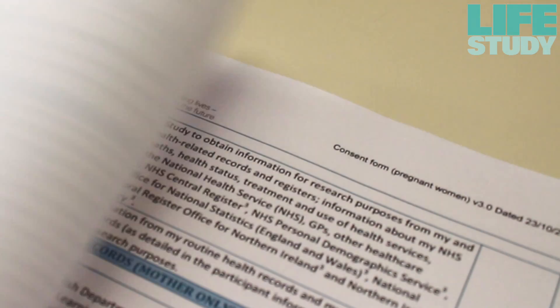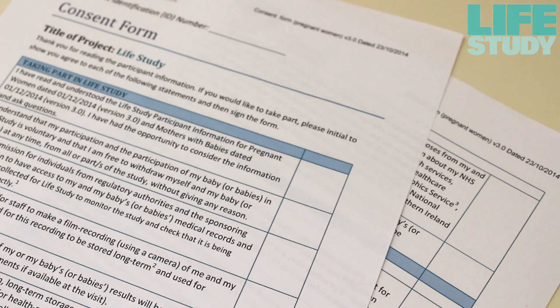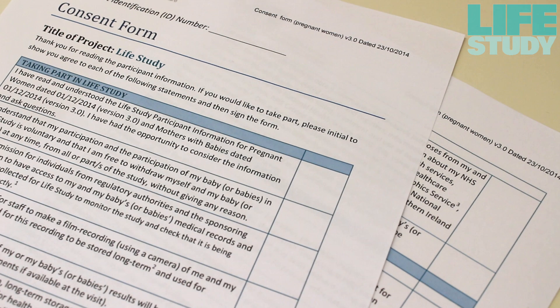Before you collect the sample, please check whether the woman has consented to give biosamples, and check that she is happy to give her baby's cord blood.